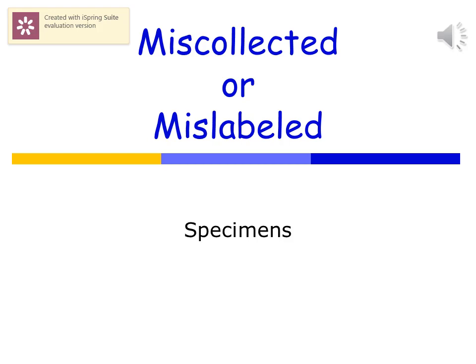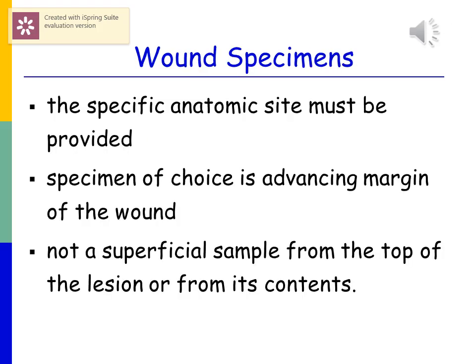One of the common errors is miscollected or mislabeled specimens. For a wound specimen, the anatomic site must be provided — for example, the left forearm. The specimen of choice is the advancing margin of the wound. You wouldn't want to just swab around the wound because you're going to get skin flora. You don't want a superficial sample from the top of the lesion; you want to really get into that wound to figure out what organism might be involved in an infection.